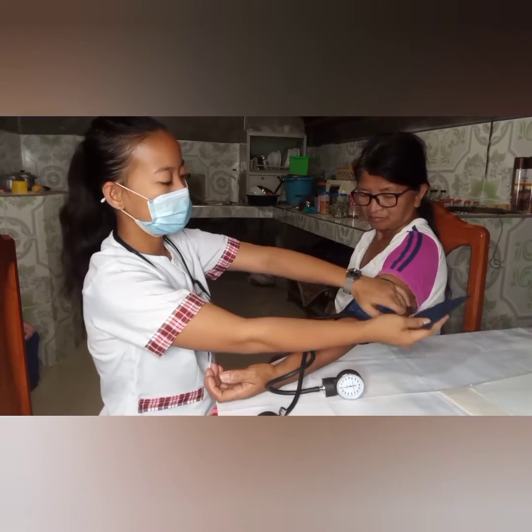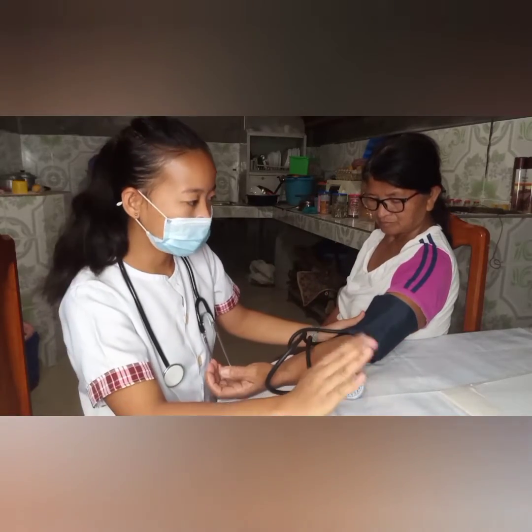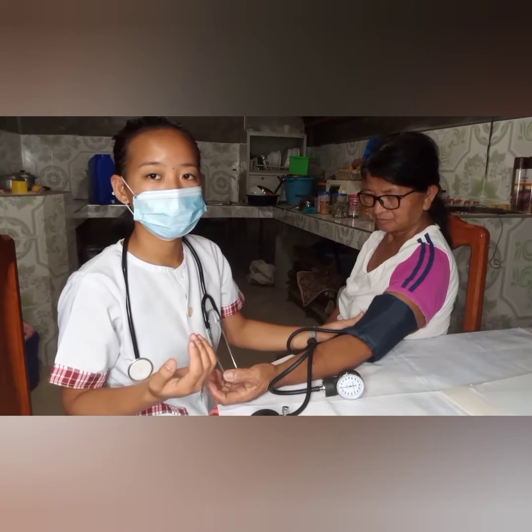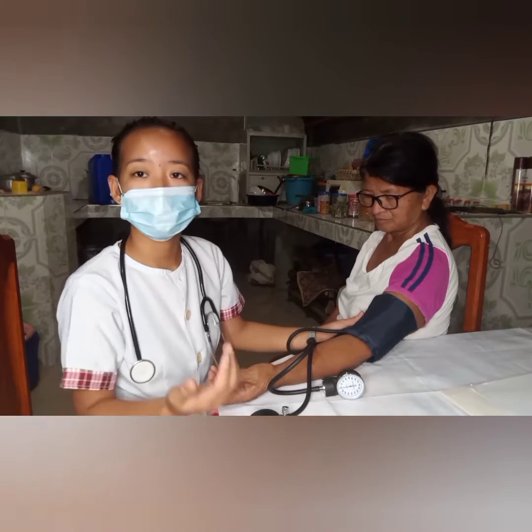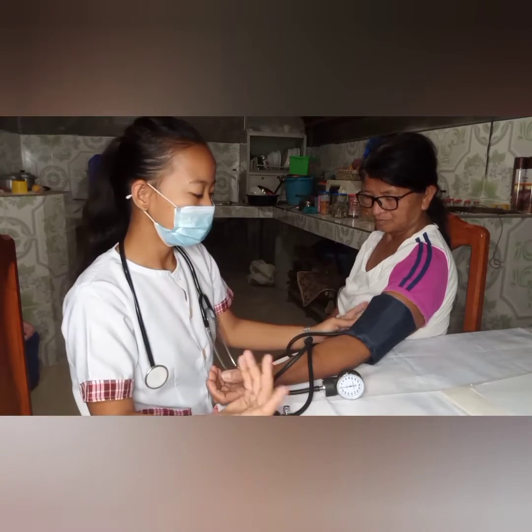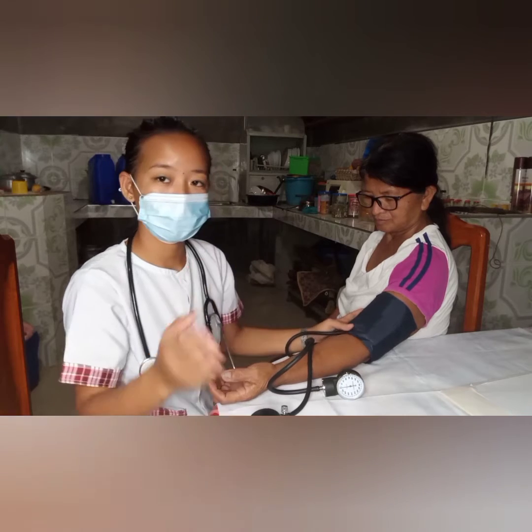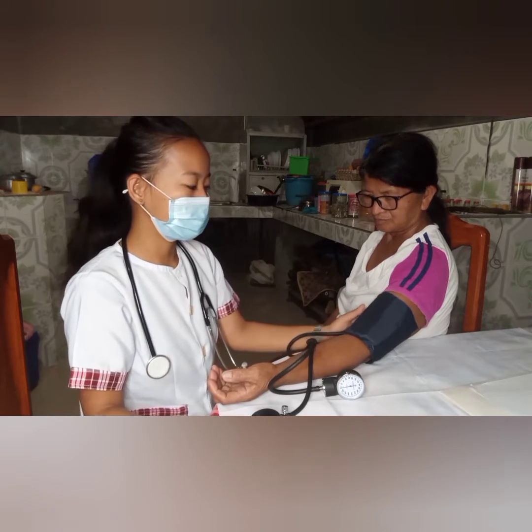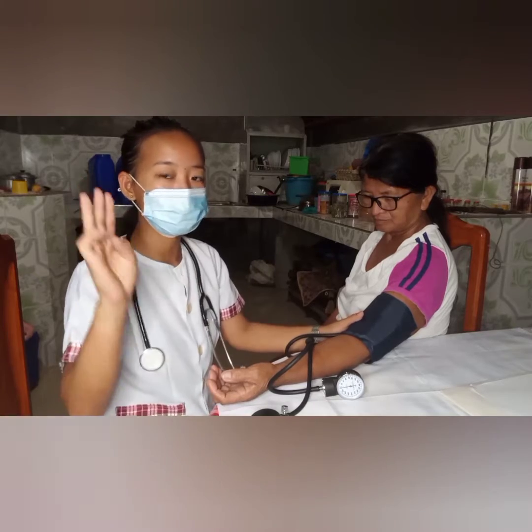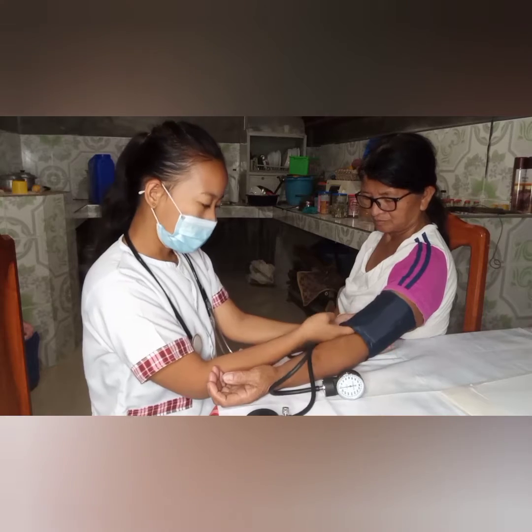We have to note that on putting this paraphernalia, we cannot lock it too tightly because it might affect the result of our test. And to know that it is perfectly intact with the arm of the patient, we can use 2 or 3 fingers and slip them under the cuff over the patient's arm.